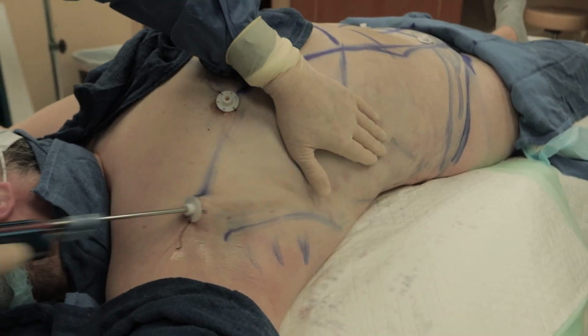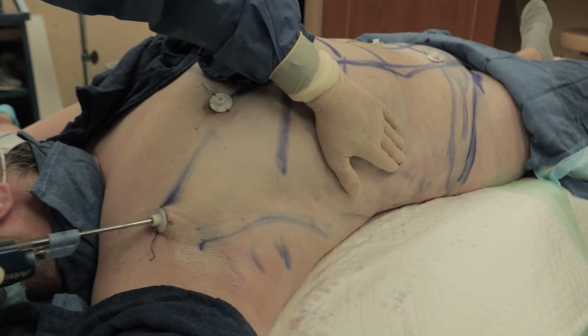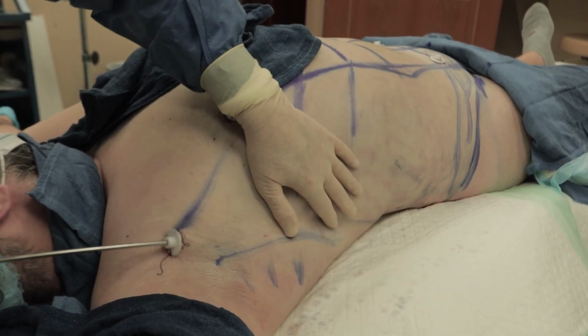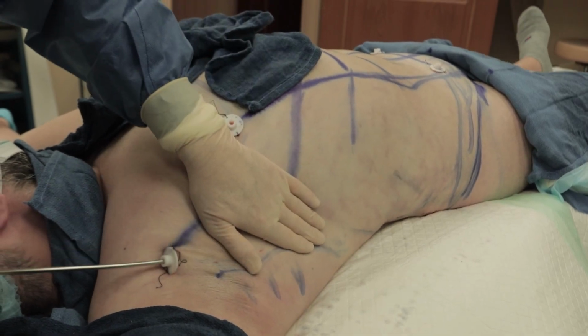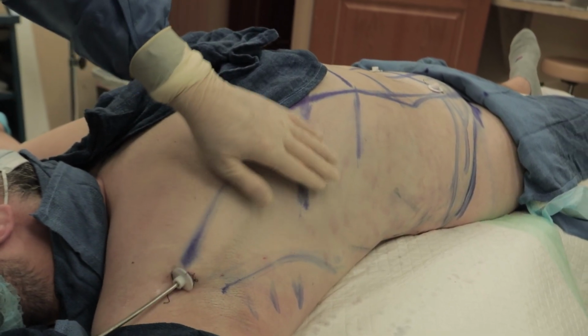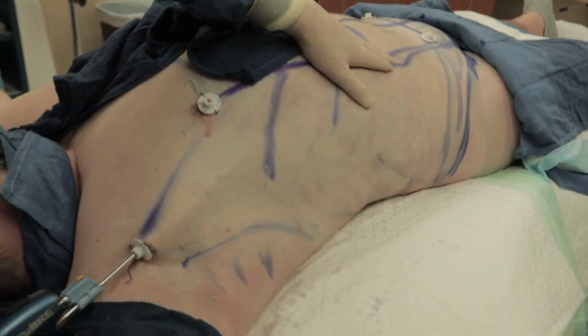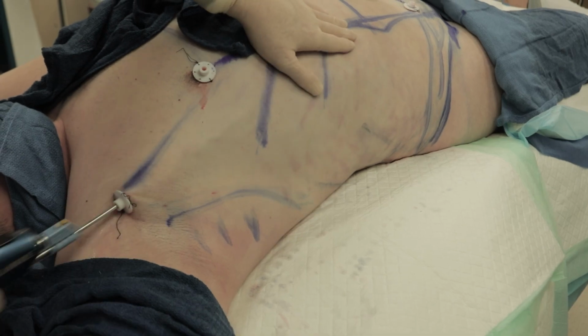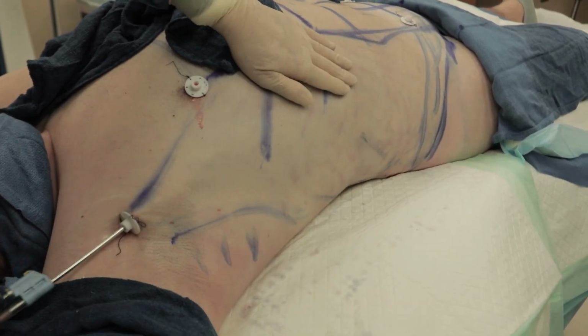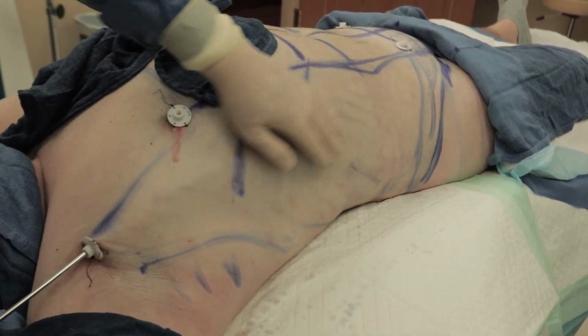So, it's an extra long cannula. They normally come in 30 centimeters. I had this one made in 40, specially made for me. And it came straight. And I bent it so I can get around, you know, my anatomy here.